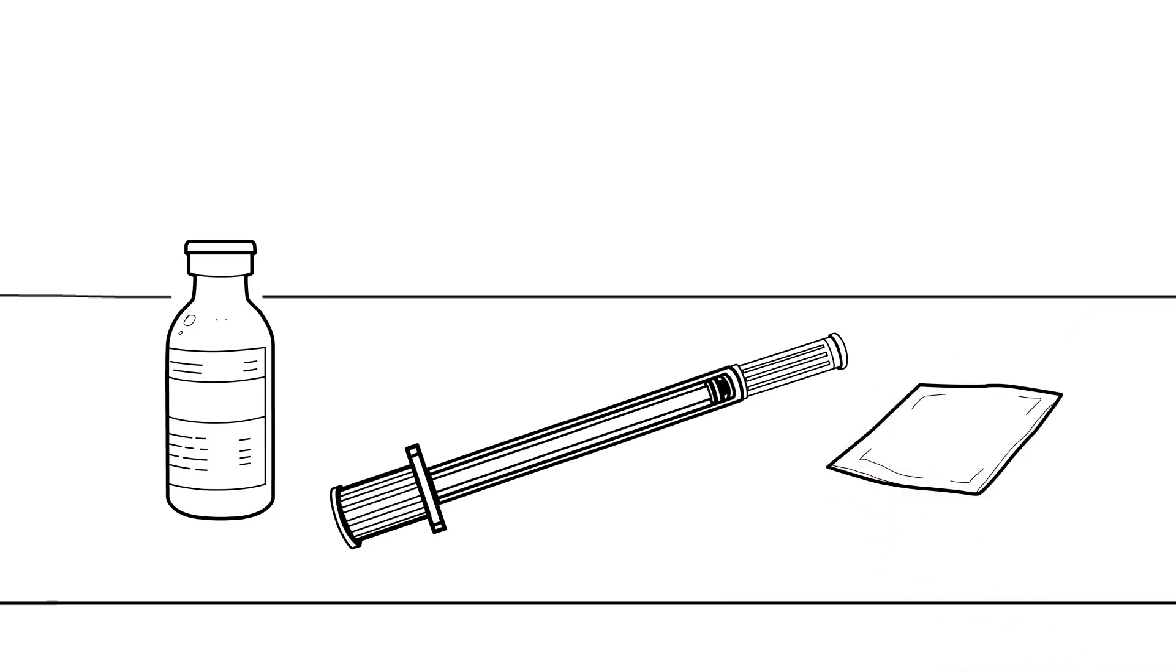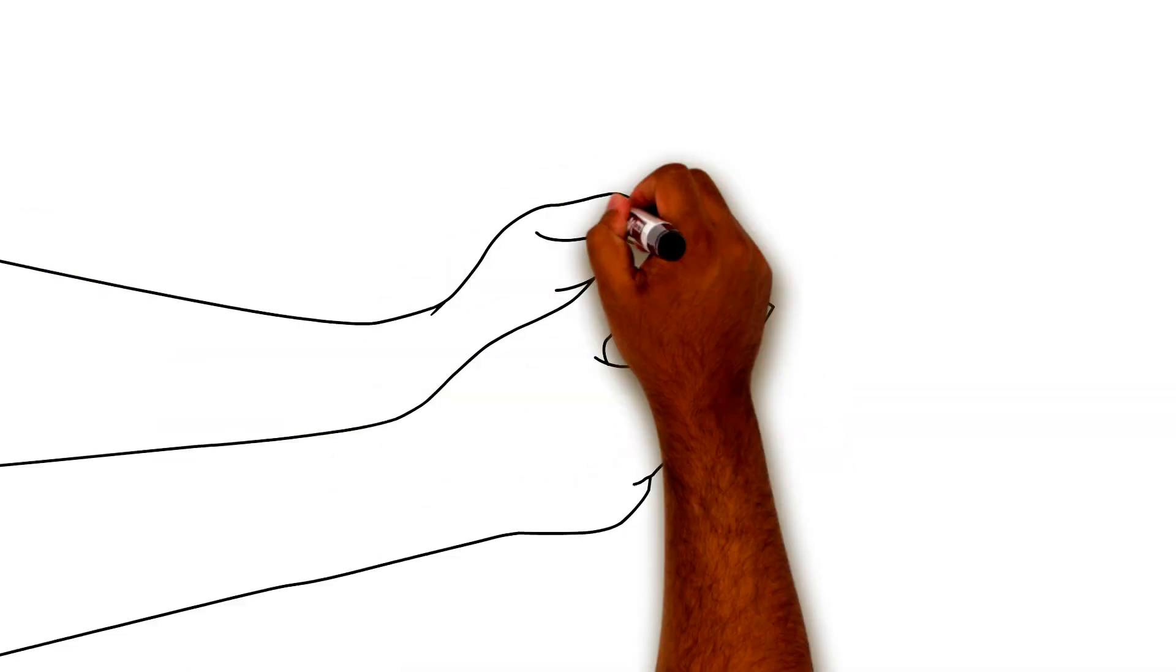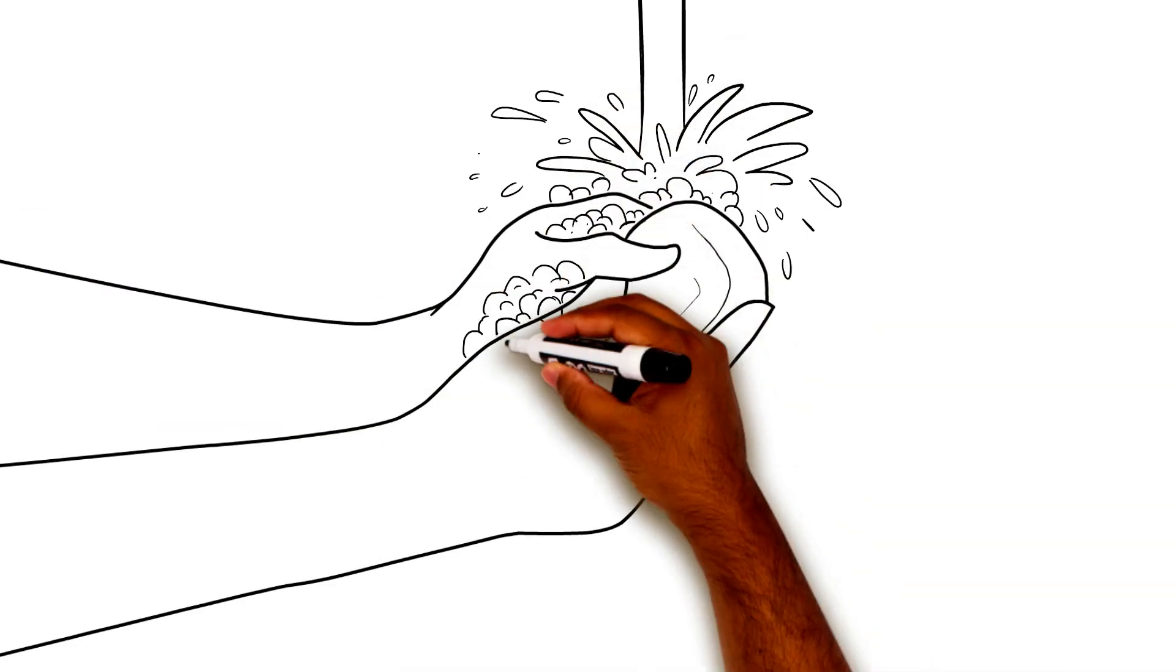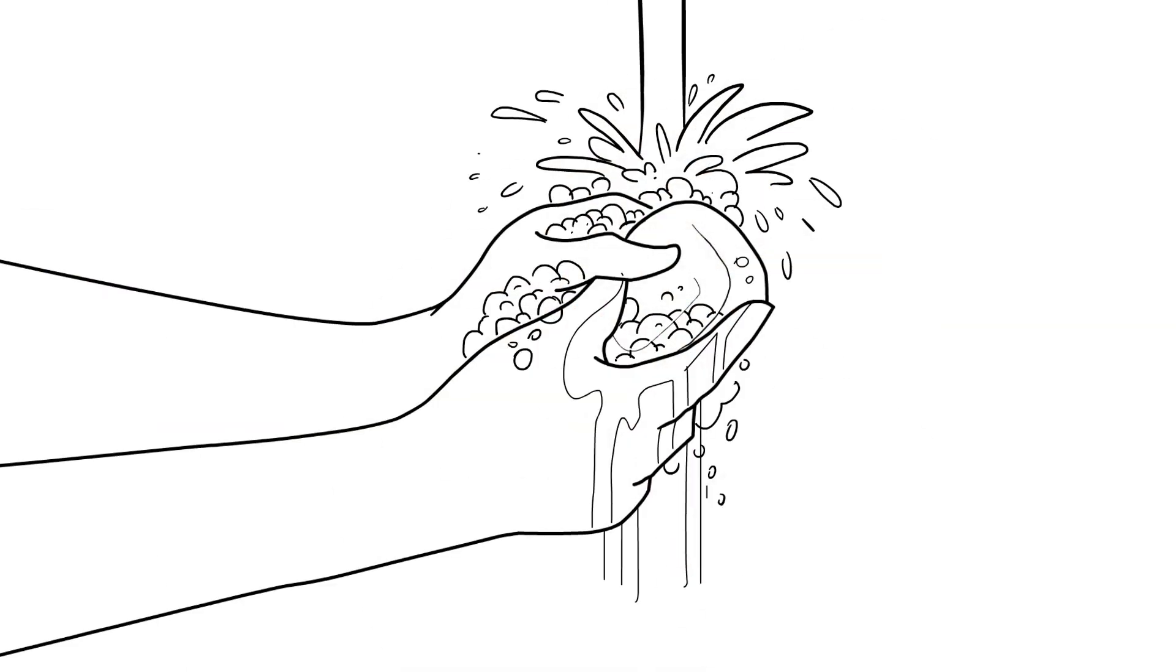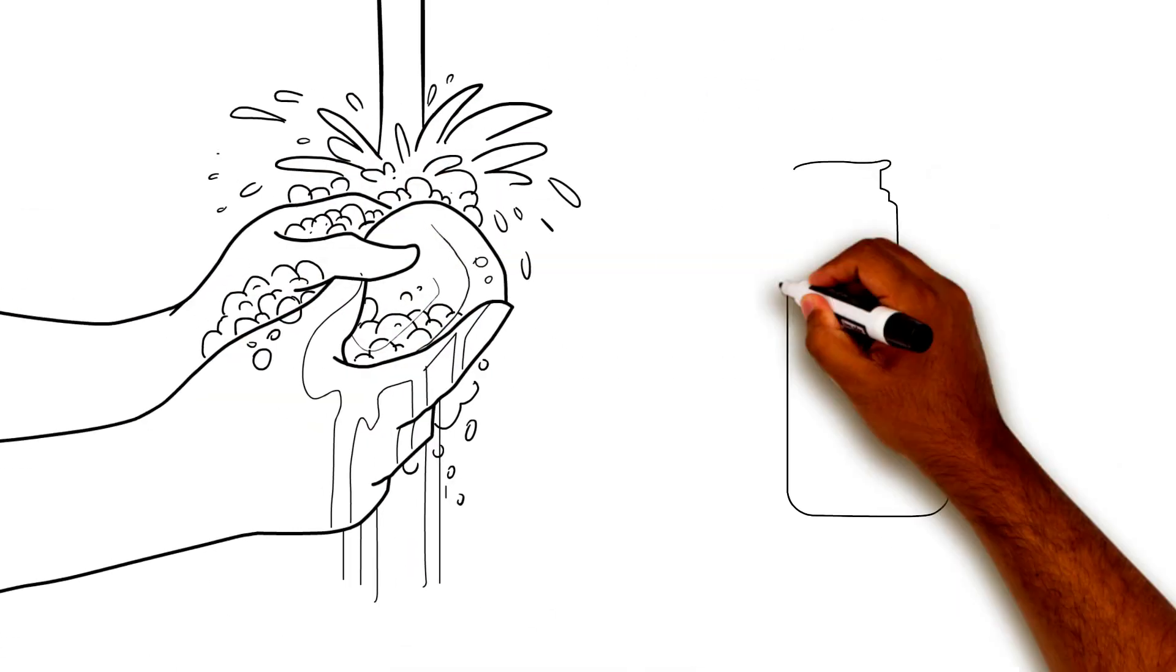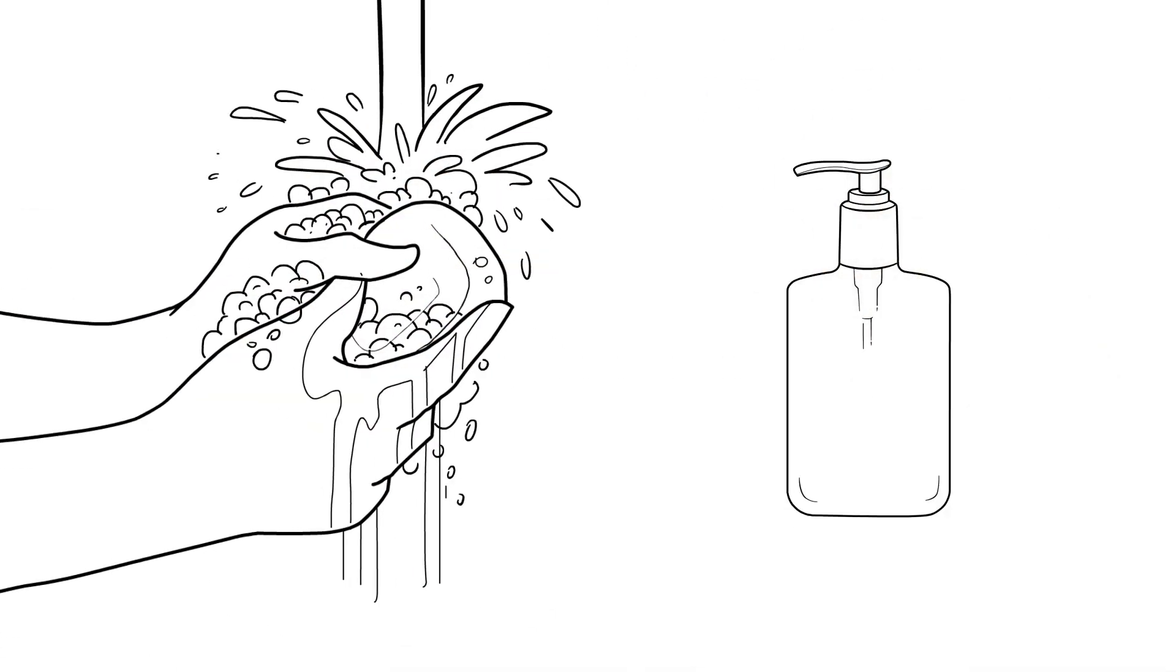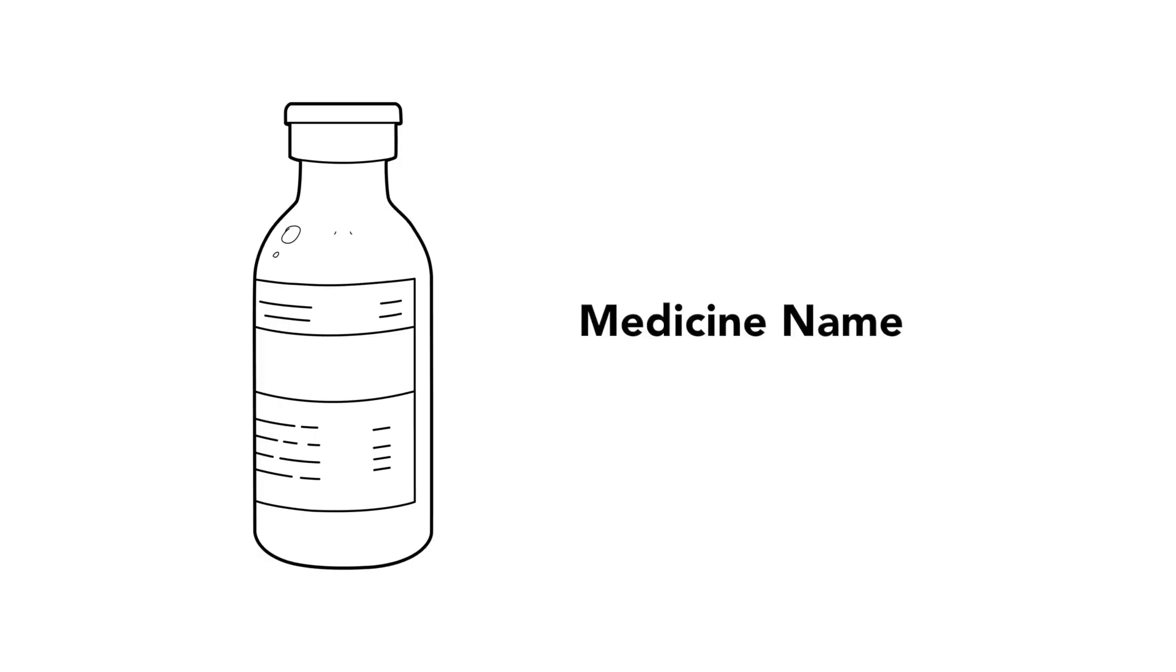Place the supplies on a clean, flat surface. Wash your hands with soap and water. You can also use hand sanitizer if you are not able to wash your hands. Make sure the name of the insulin on the vial is the medicine you want to give.